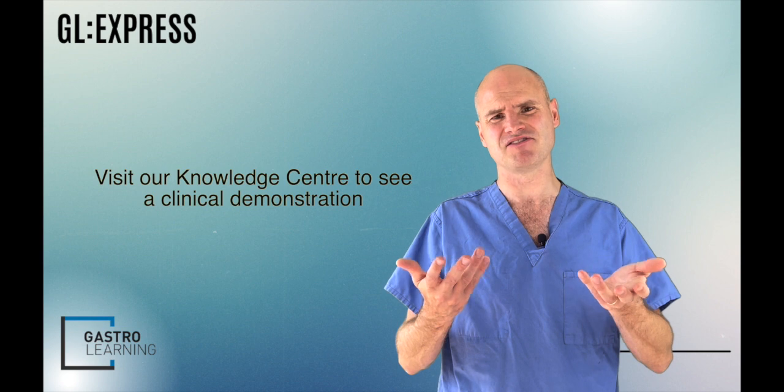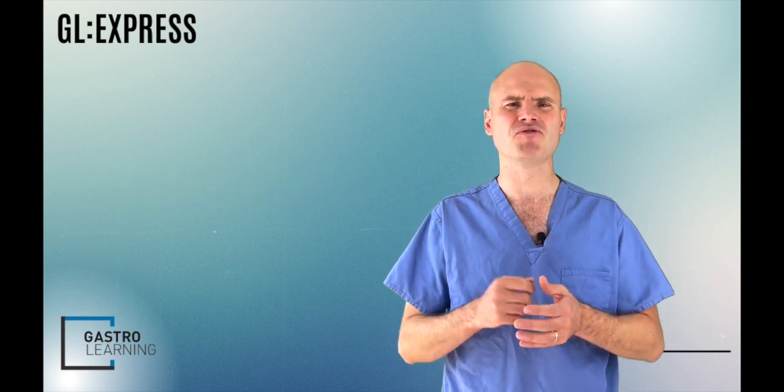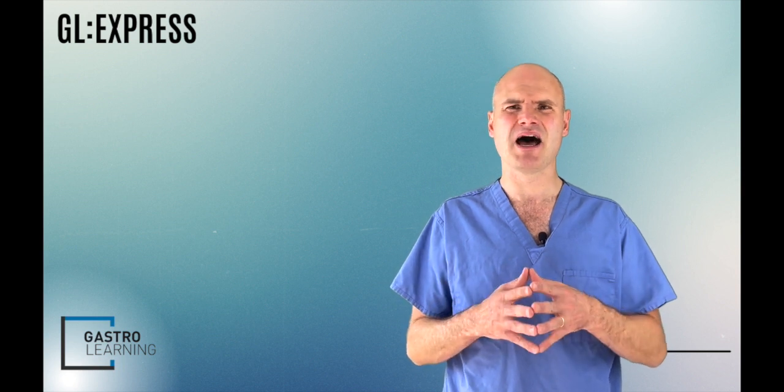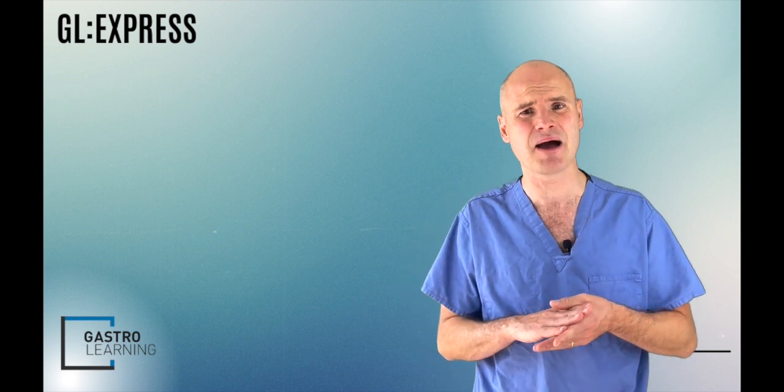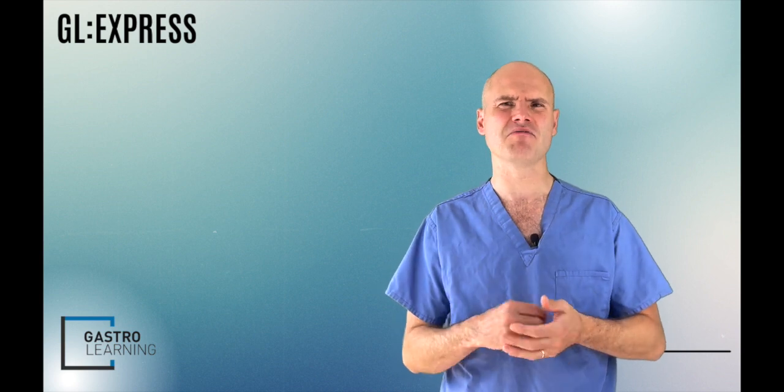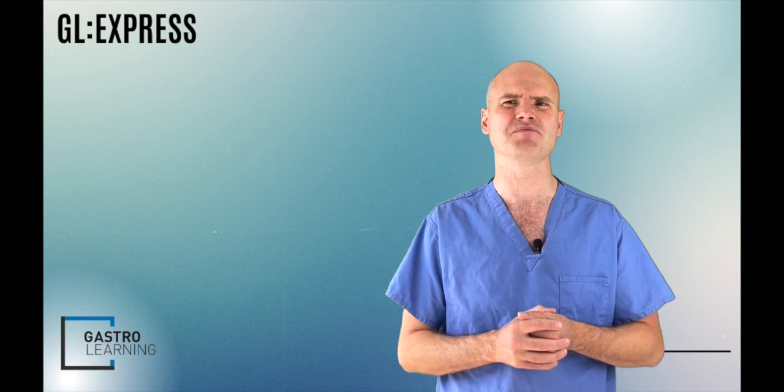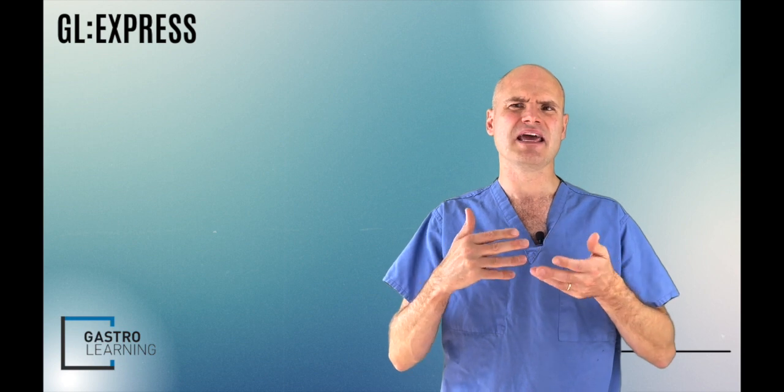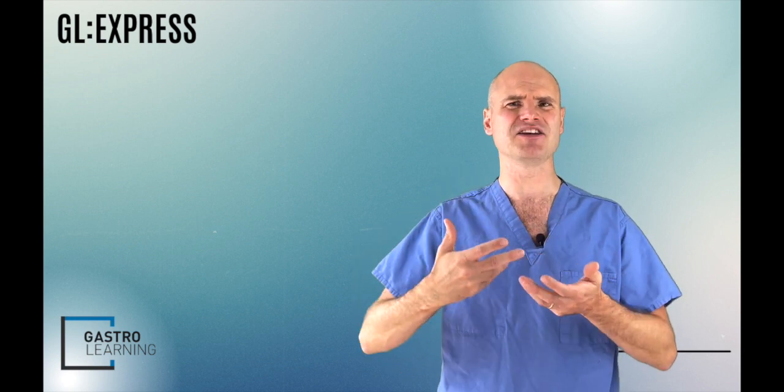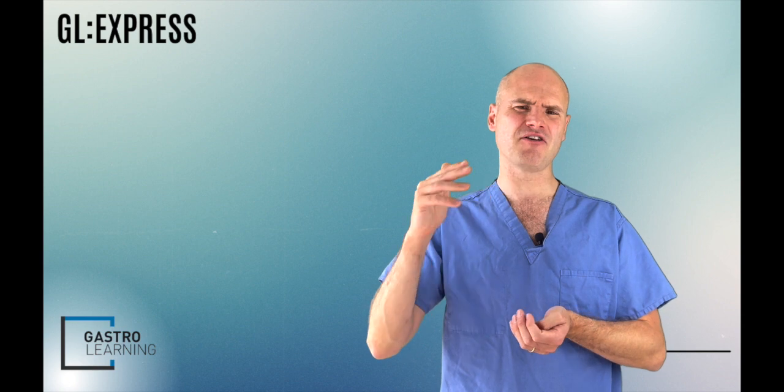Finally moving on to my last tip, and this is about the pedals. What we often see with pedals is there's a tendency for people, particularly when they're starting, to tap the pedal rather than keeping their foot down. Now the diathermy machines are very clever and they monitor the current and voltage they're producing at all times, and therefore determine how long each cutting cycle should last and how long each coagulation should last. If you take your foot off the pedal and tap instead, what you're doing is stopping the machine from being able to make these calculations and resetting it back to the start every time. Therefore, holding your foot down on the pedal allows the diathermy machine to effectively monitor how much cut it's producing throughout and when it should stop and move on to that coagulation phase.